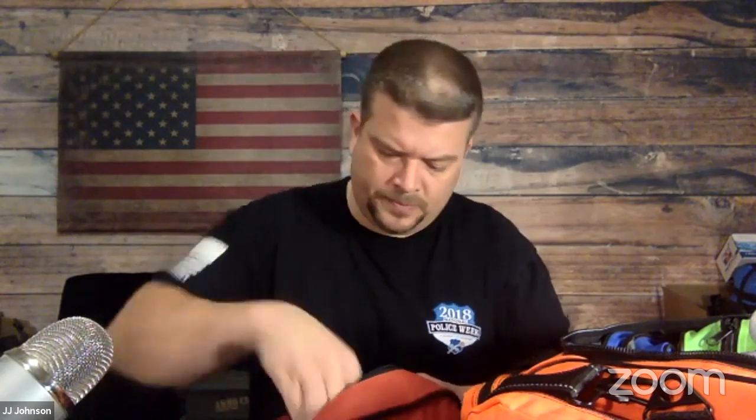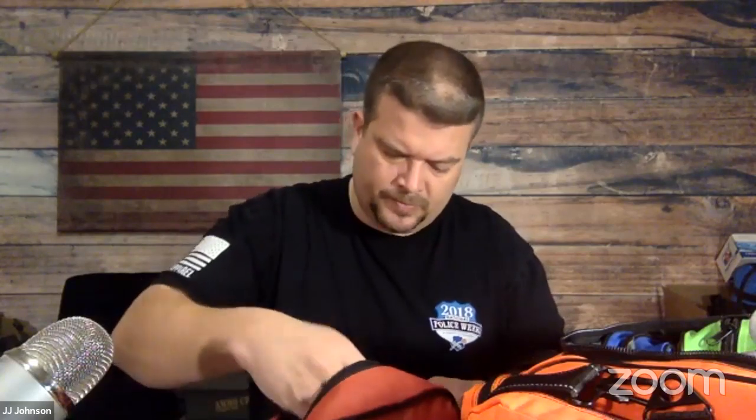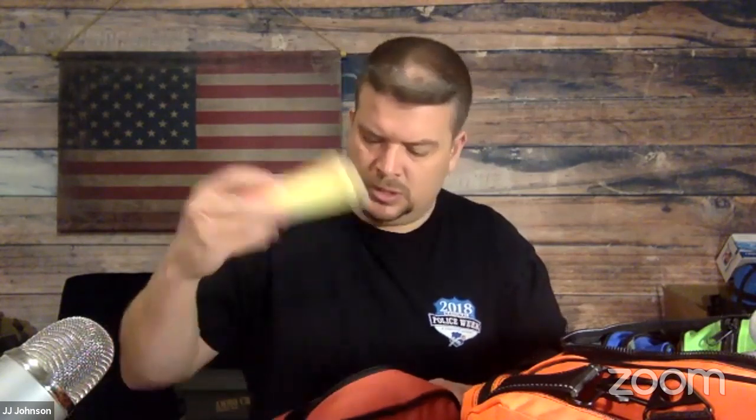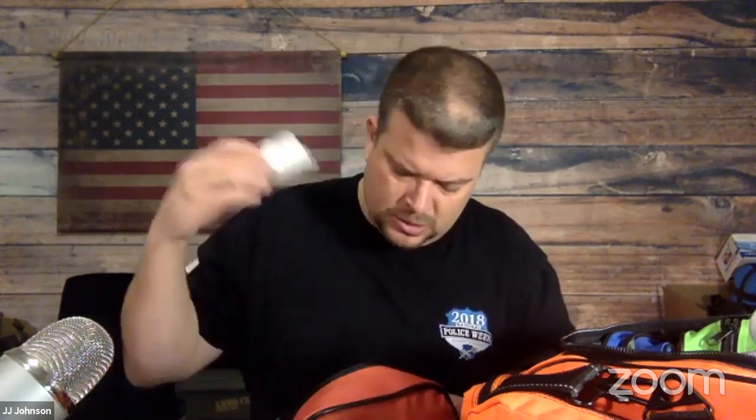Sensi wrap. So kind of that cling wrap kind of stuff for holding the bandages in place. Another one of the little ace wraps. Another roll of gauze. Another roll of gauze.